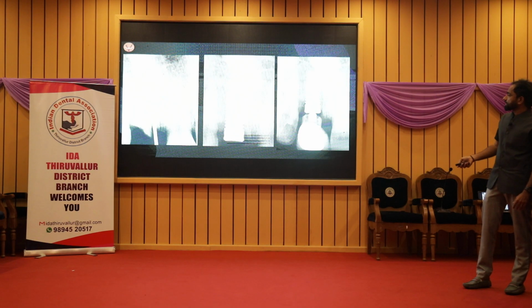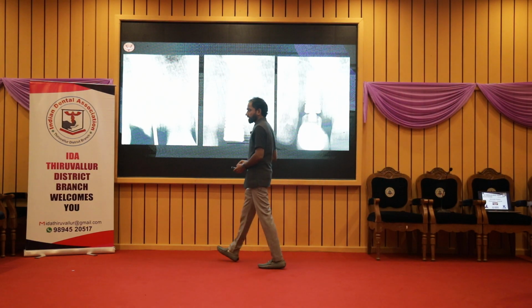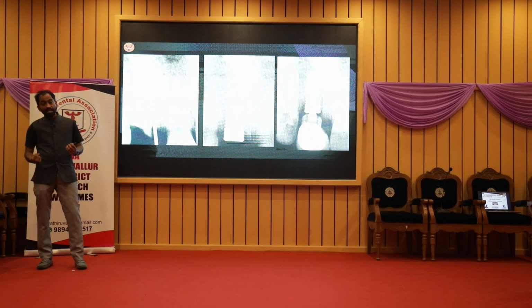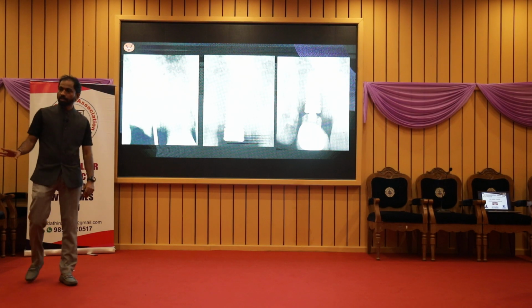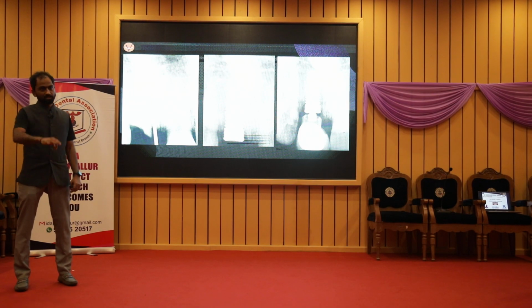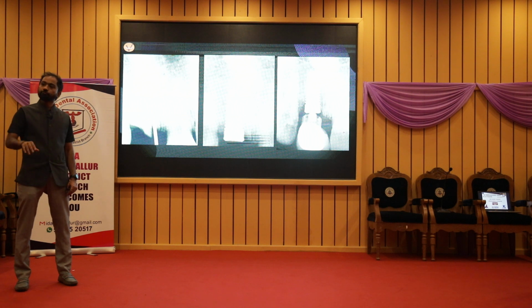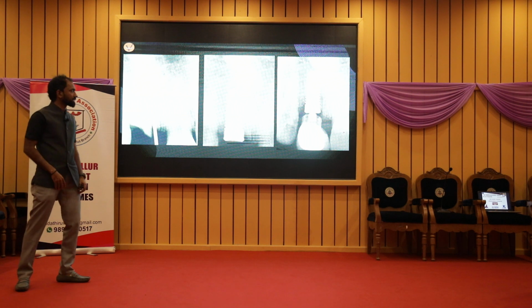And I've extracted it, and this is mandatory, as Sir rightly said. For implantology, gone are the days where you use your forceps and do buccal and lingual traction. Never do it. Even if the patient is not getting an implant, I would advise, if you have to extract a molar tooth, slice it, take it out single root by single root, and preserve the interradicular bone, because in future he might come back to you to place an implant. So that is how it is.